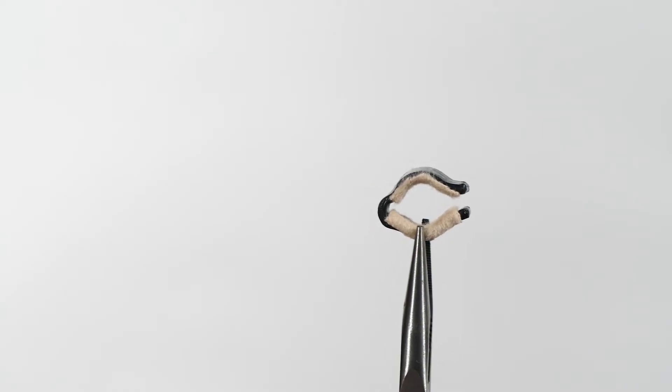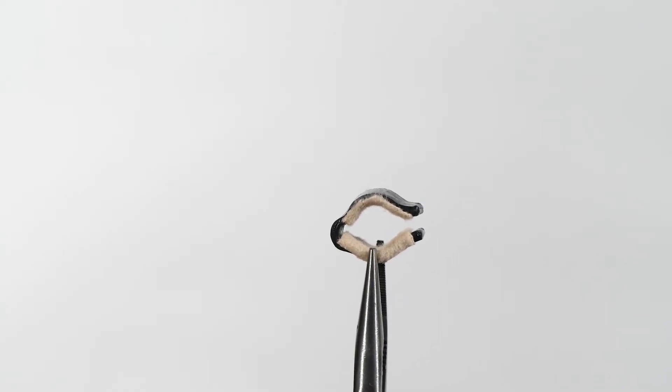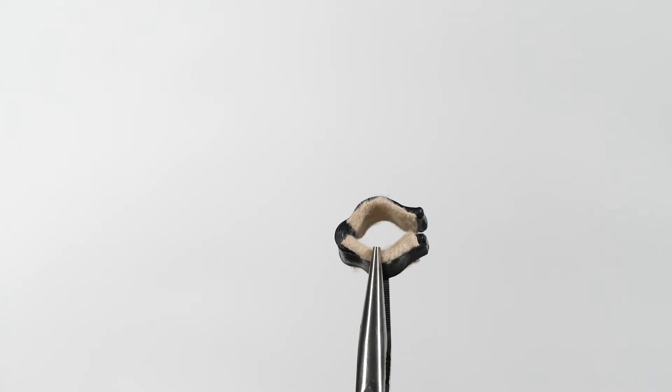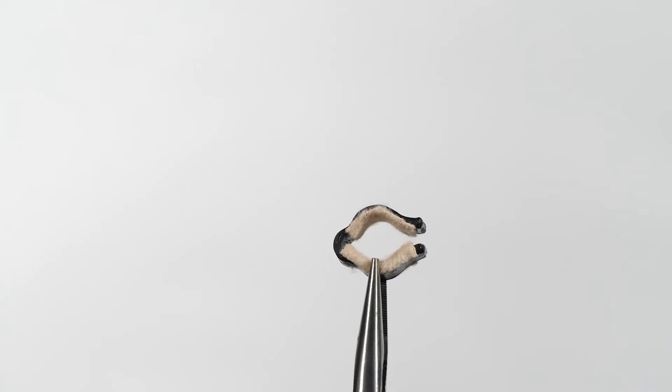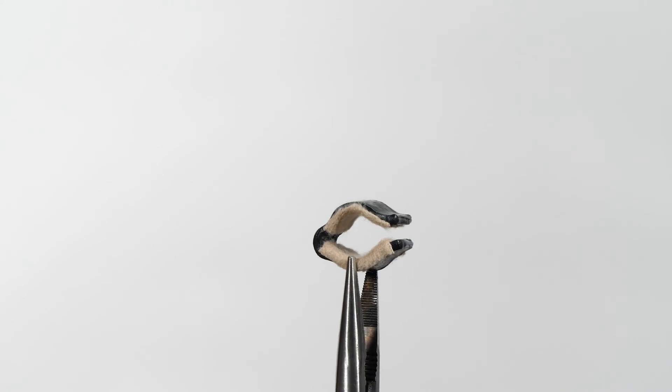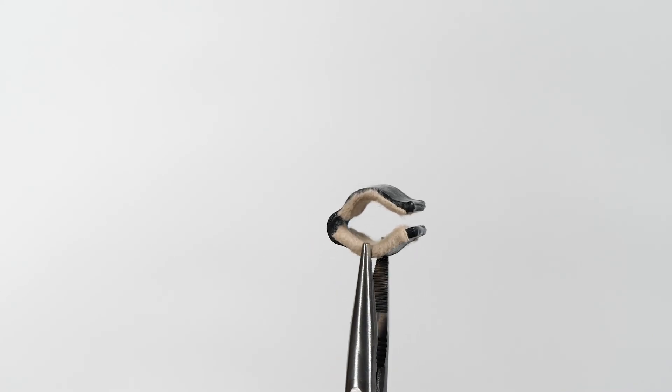Here you can see a fully completed pulley protection splint, molded with the collateral bulges on the side, with moleskin on the inside to protect breakdown of the skin while it's on the finger.